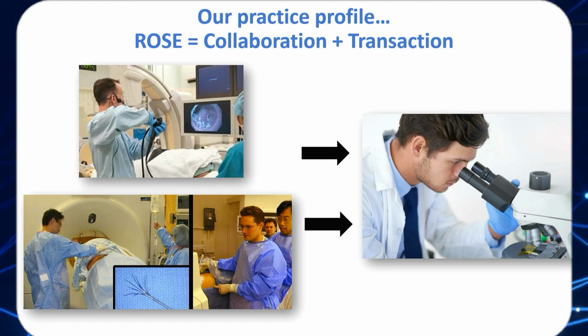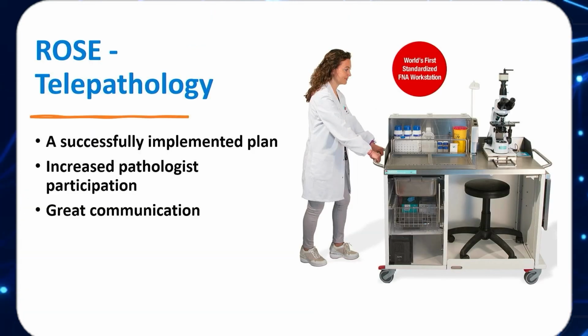In our practice, even the cardiothoracic surgeons do EBUS procedures in the OR at crack of dawn usually, for some reason, when they are trying to operate on a patient and they want to stage it before proceeding forward. So again, this is basically a review of how the practice works. The pulmonologist preps the patient for an EBUS procedure, and then we are physically there with our microscope, looking at the sample itself. So again, being physically present is really important in getting a good sample upfront.